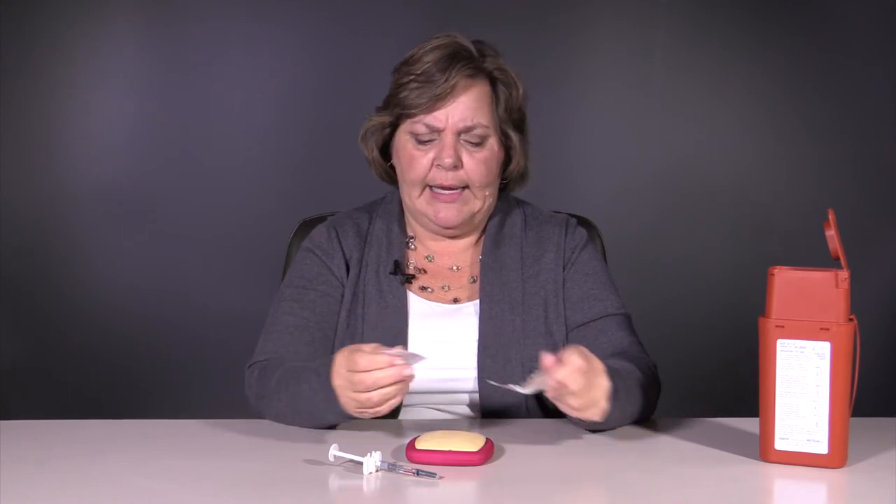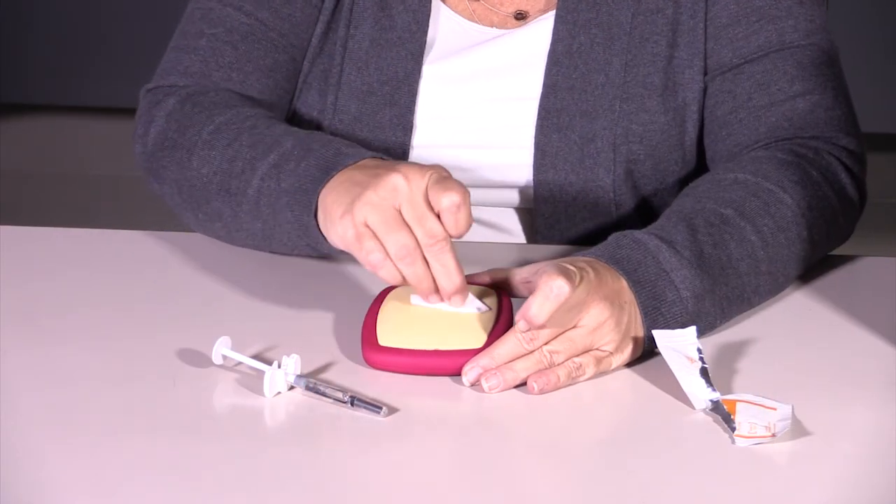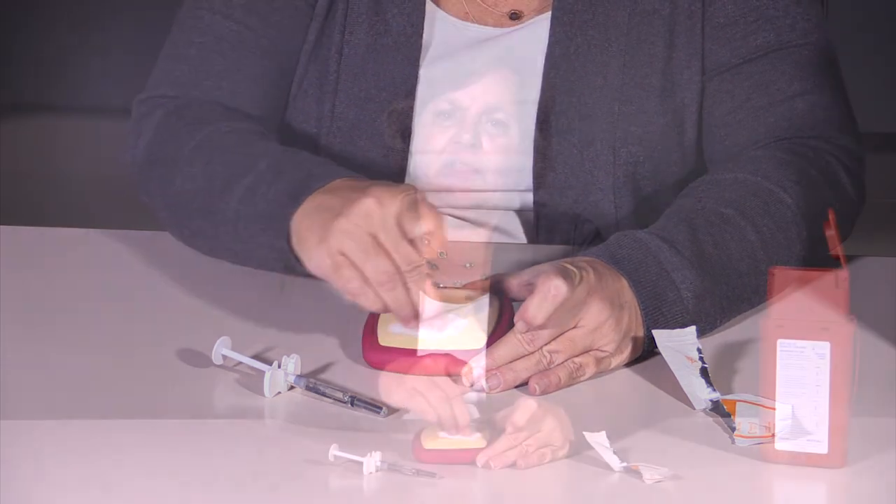So what we're going to do is prepare our skin first. You select your site for your injection today and you're going to take your alcohol wipe or your cotton ball with alcohol and, in a circular motion, wipe that area for about 30 seconds. Then you're going to let that dry.